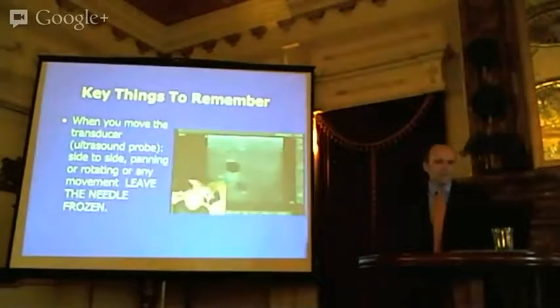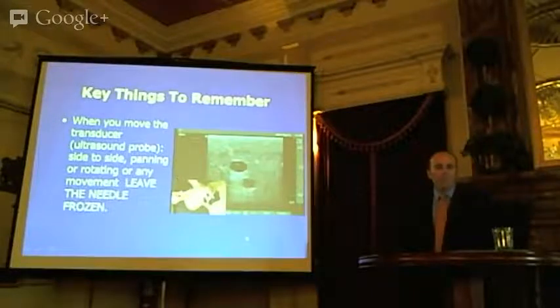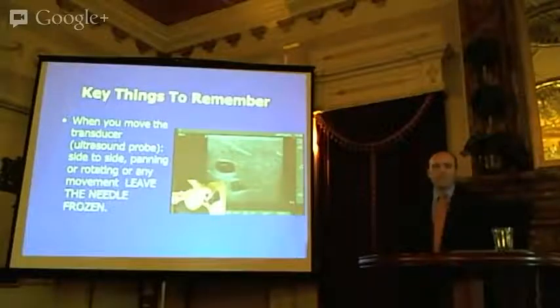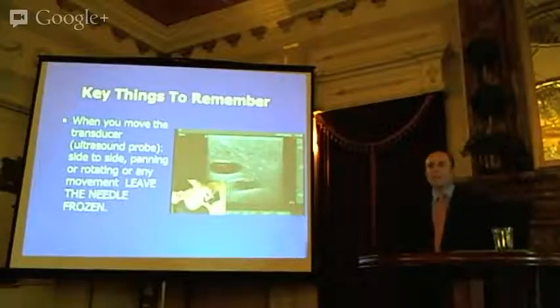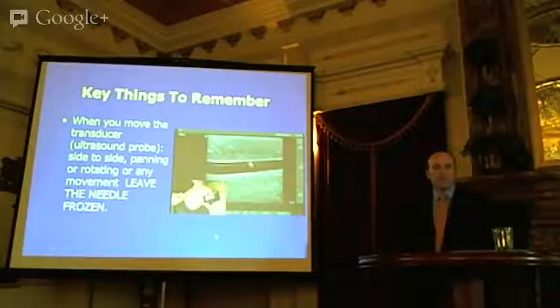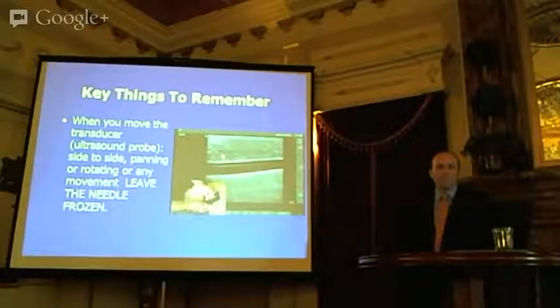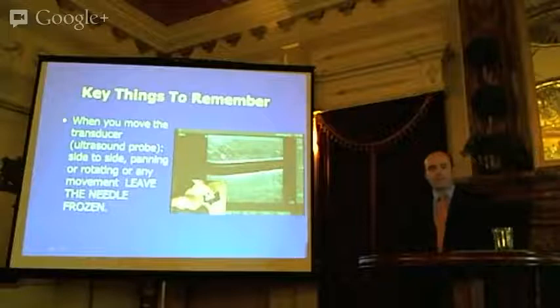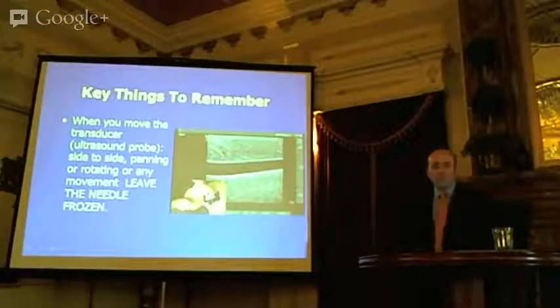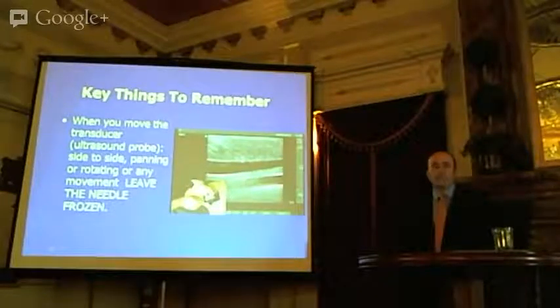All right, here's an example of moving one or the other. This looks like a slow, methodical process, but once you practice at it, this happens automatically, in a matter of seconds. These kinds of adjustments are very automatic. So I can decide which side I'm going to see the needle from. So many people say, I don't know what side the needle's coming from. Well, put your finger underneath one side of the transducer, or move the transducer in one direction or another. Where does the new information come on the screen? That's where the needle's going to come from if you put the needle on that side.